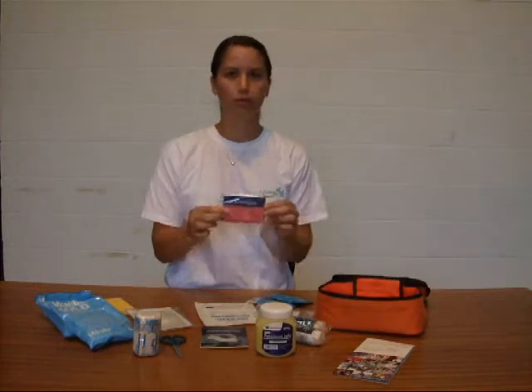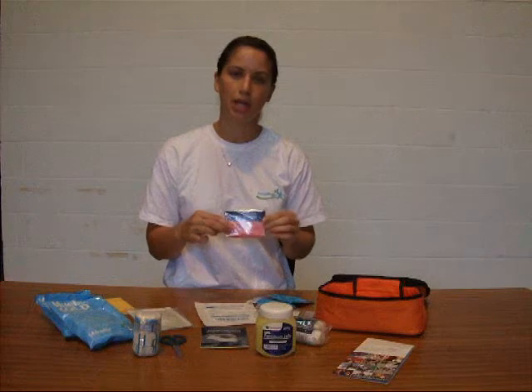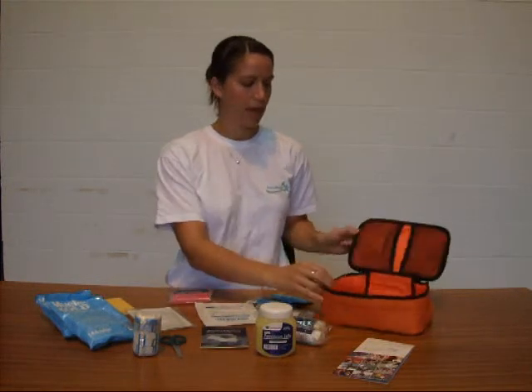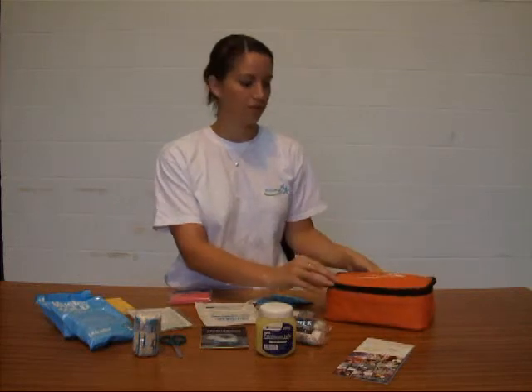Last but not least we've got a foil blanket — if somebody's laid on a pitch and they're injured, cover them up and keep them nice and warm. And that is the content of our basic first aid kit.